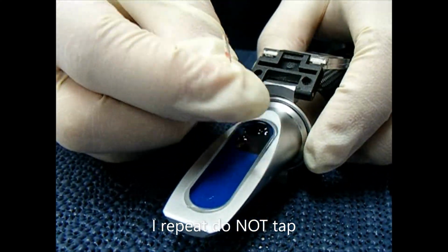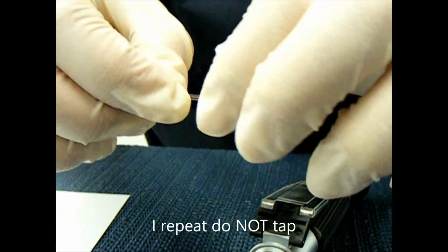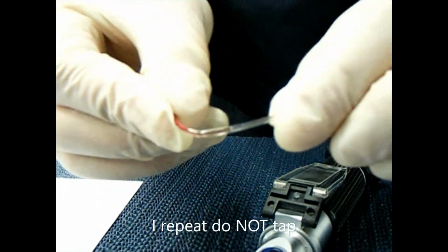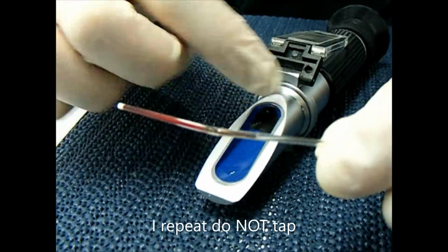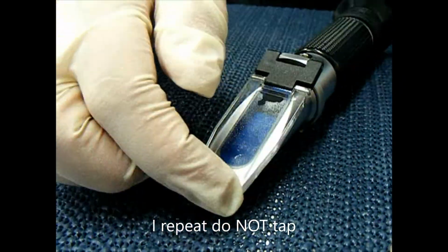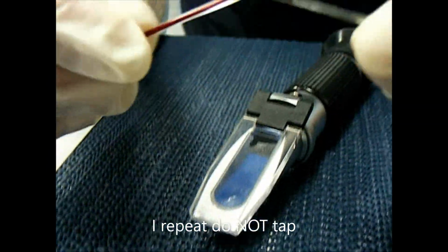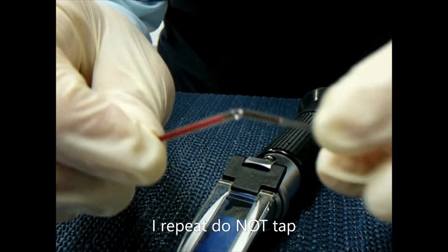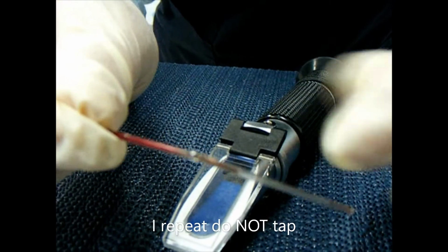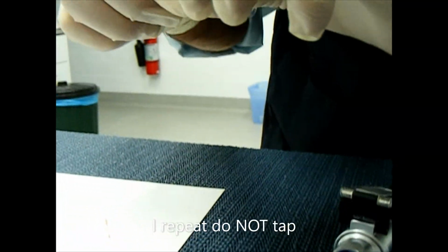Now, you need to continue to do that patiently. You might need to break another tube like this, so you've got enough plasma to get a reading, because if you haven't got enough liquid, when you put the pane down, it doesn't make a seal, and so you won't get a clear reading. Here's a warning for you. Some of the PCV tubes are not glass, they're plastic, and therefore they don't break. So that's no good. So make sure you choose the glass tubes at the beginning.